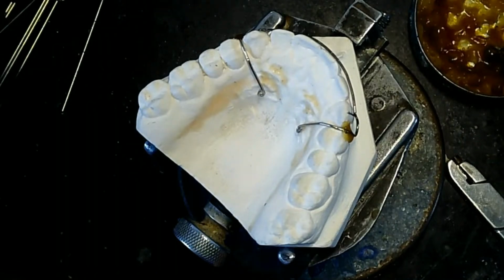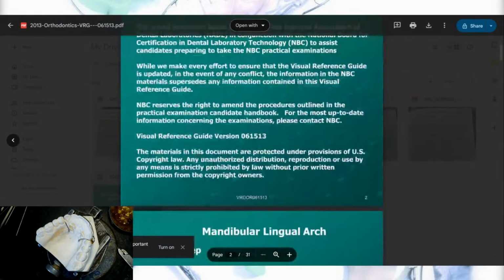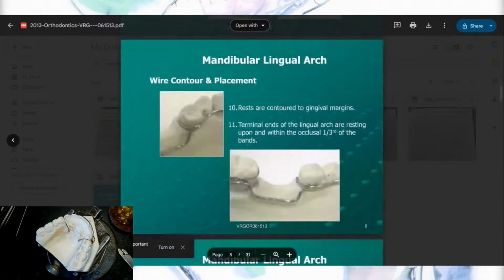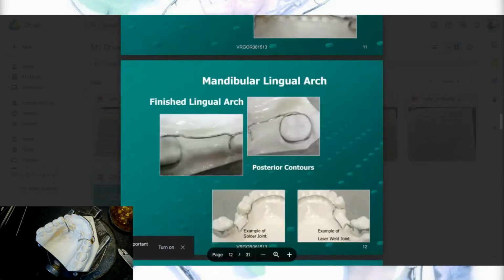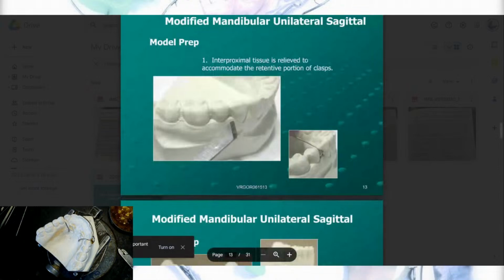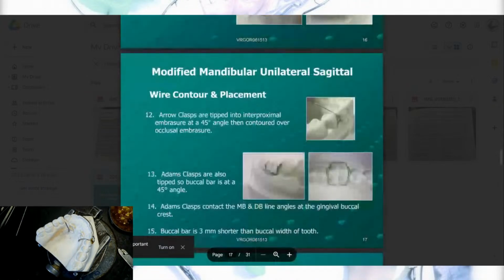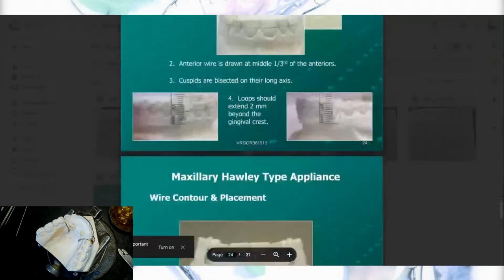So we'll move on to this exam. Let's see if I can pull this up. That link that I have down below goes to the NBC website, it should have a download link for this. For those Patreon members, I have provided it in your Patreon account. I don't know if this tells me. Come on. There we go.